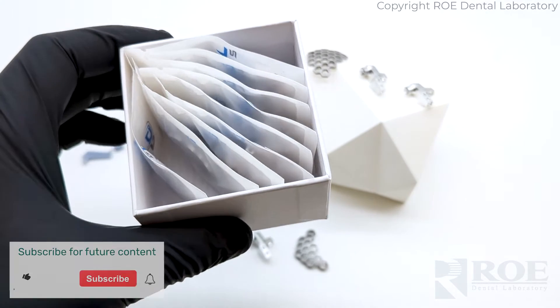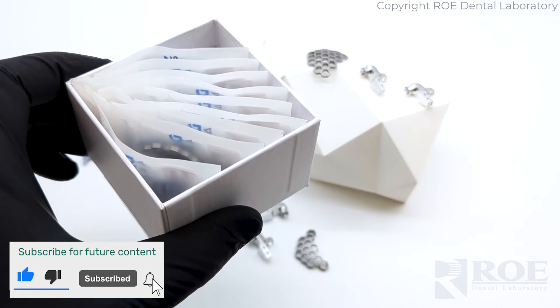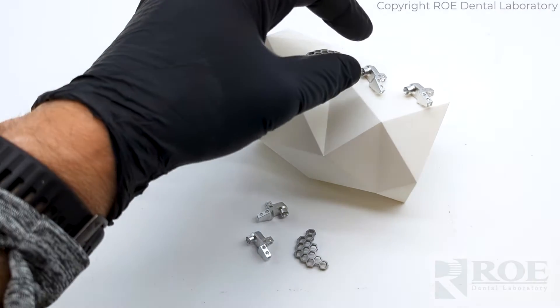This video is going to discuss all the items that come in the Grammetry OptiSplint kit. All the items are here in this video image and let's go through them one at a time.